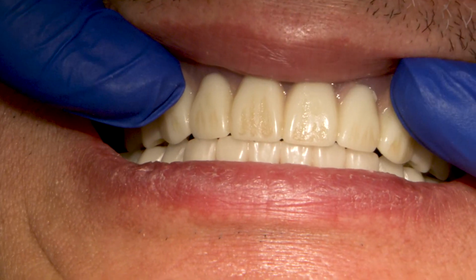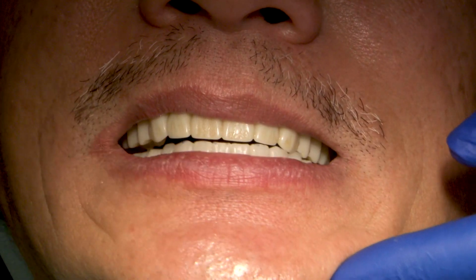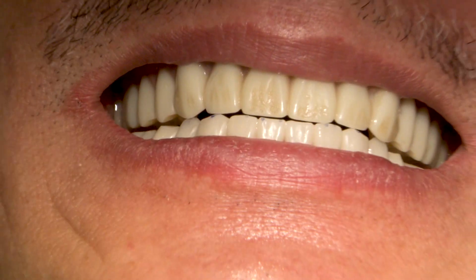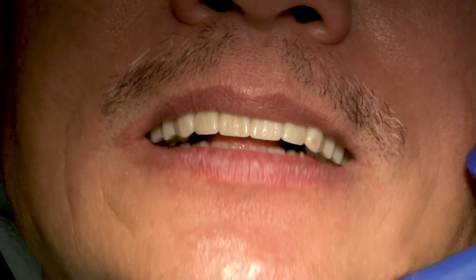Capturing the appropriate bite registration at the correct vertical dimension is a very important component to a successful full arch BruxZir prosthesis. This can be the trickiest part of the whole procedure. However, it is important to evaluate the setup and make any necessary changes at this point. It is the easiest time to do so.